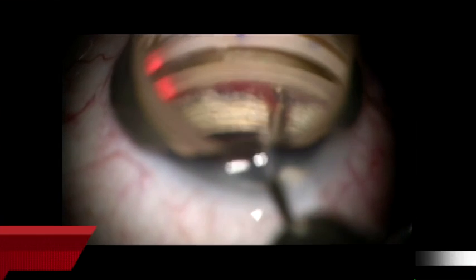Through a side port — a one-millimeter side port incision — the iTrack micro catheter is inserted and aimed toward the position of the otomy. A smooth jaw intraocular forcep is then inserted and the micro catheter tip is gently grasped. The tip is positioned toward the otomy and very gently inserted, and the tip is then advanced in a 360-degree fashion. Note it is important here that your nurse keep the catheter parallel, and also note that I zoomed out here so as to allow the surgeon to absorb in his peripheral vision the tip of the micro catheter as it comes around.